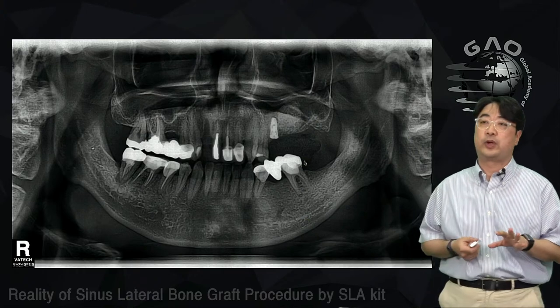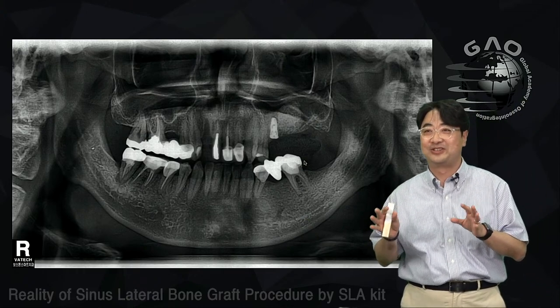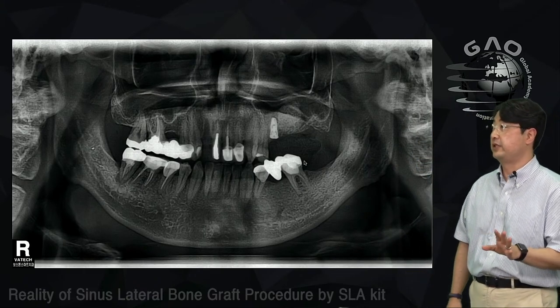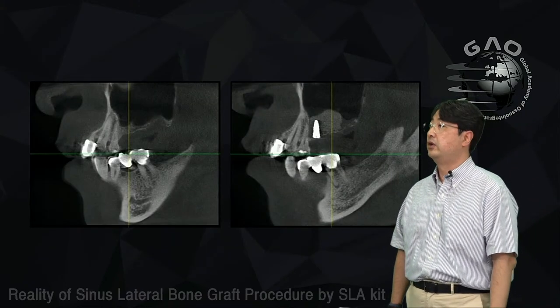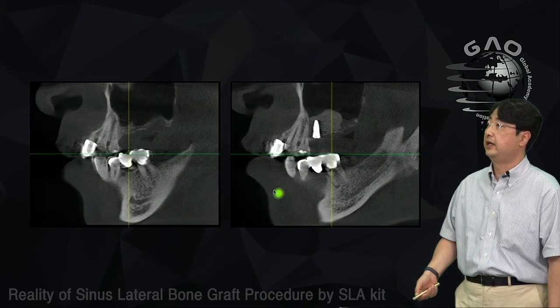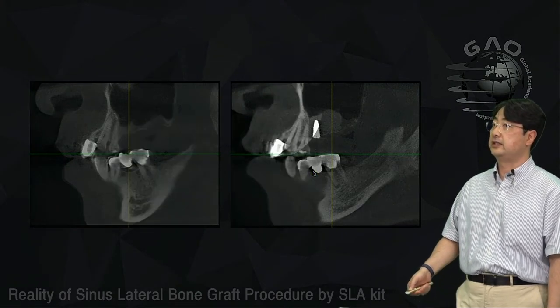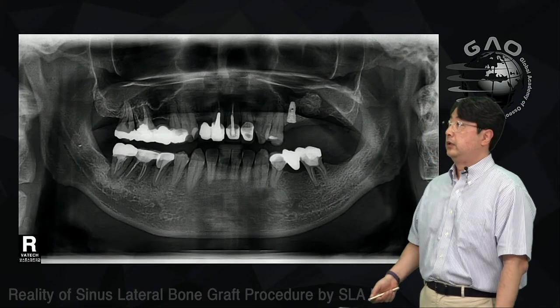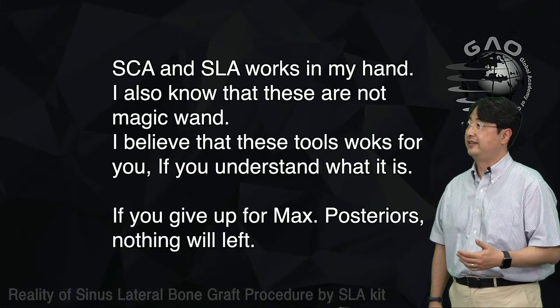But this way, you can use crestal and lateral, mix and match together, to easily make a sinus bone graft in different situations, right? So this is a CT scan before and after. This is before and this is after. Okay, so this is a panoramic radiograph after a few months.